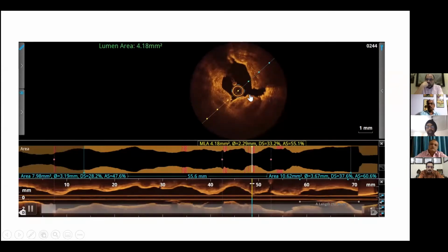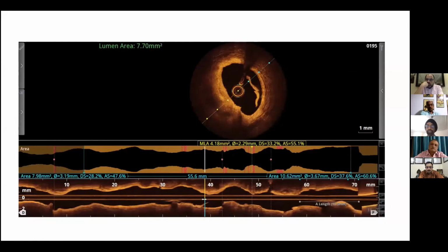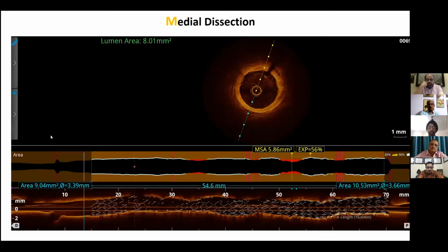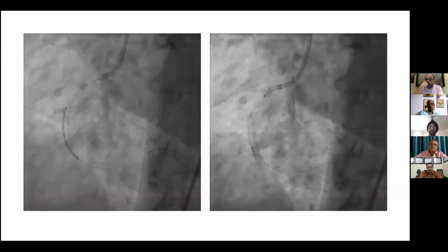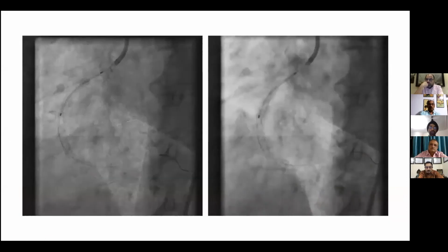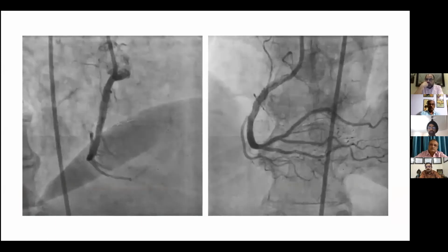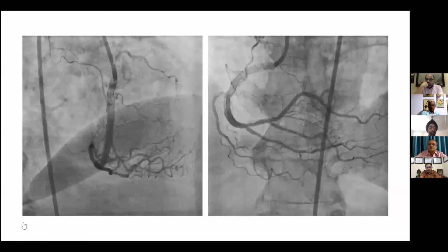And see, you have made good room for the stent to come in. We were not satisfied in some areas. We went with a non-compliant balloon to further dilate after the lithotripsy and then placed in the stent, which was 3.5 millimeter distally and 4 millimeter proximally. And then we went ahead, post-dilated with 3.5 and then 4 millimeter balloons, and obtained this kind of result angiographically. Which also looked quite reasonable on OCT, as you can see here.